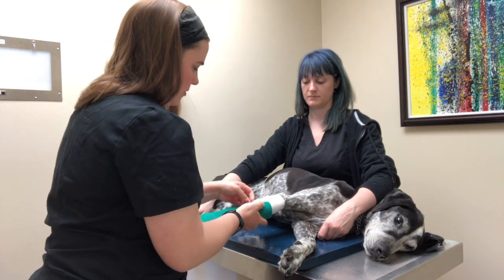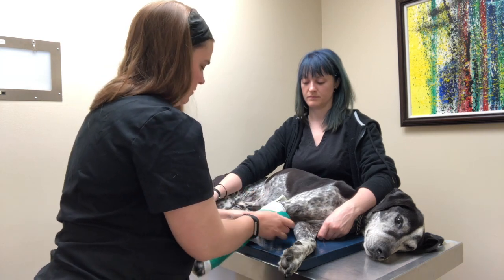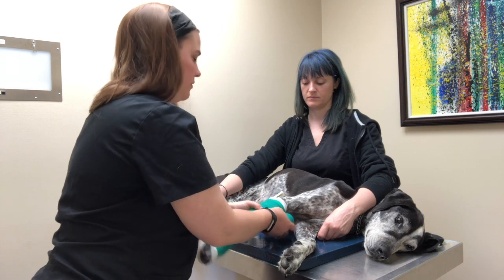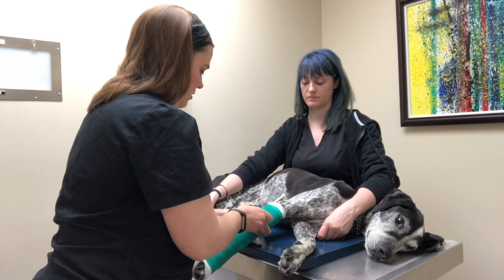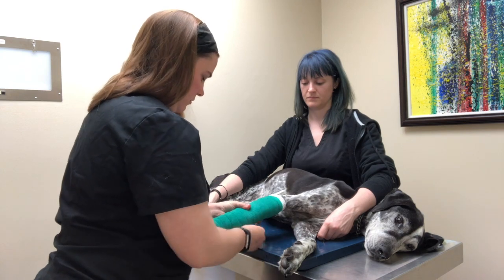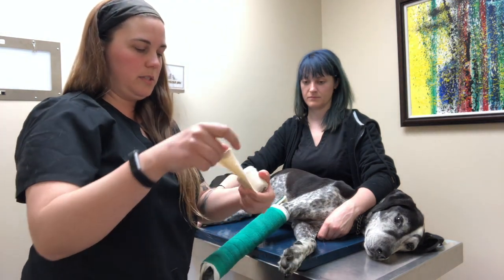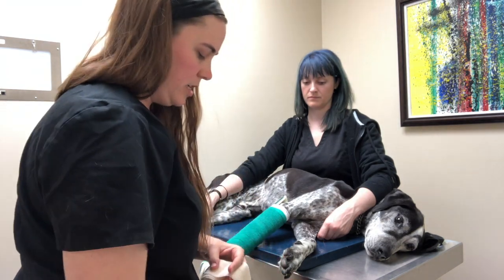Pulling it tight so it's secure, but not too tight. And same thing at the top as the bottom, we're going to leave some of our cast padding out. And you can add some sticky elastic tape to your foot to give the patient a little bit more stability when they're walking around.